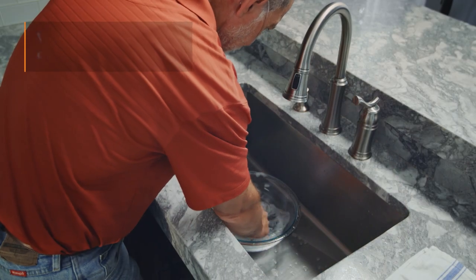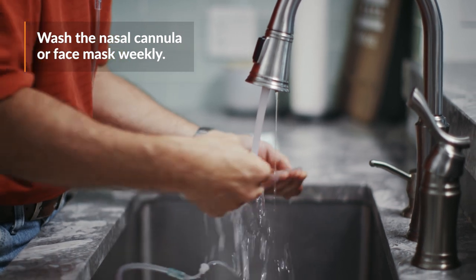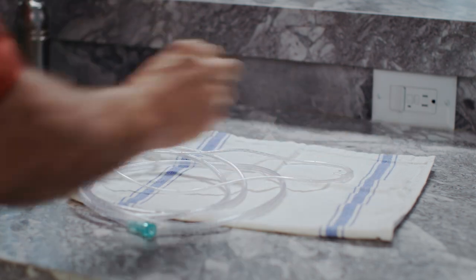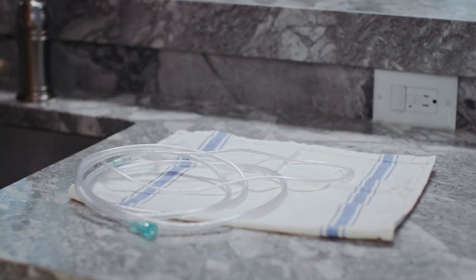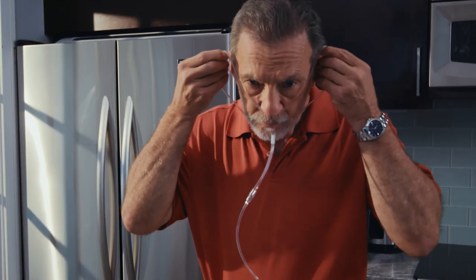Remember to care for your system by washing your nasal cannula or face mask weekly with mild dish soap and warm water, and let air dry. Clean them more frequently if you're sick. Be sure not to get water in the tubing and replace it if it is damaged. You can get replacement tubing from your oxygen supplier.